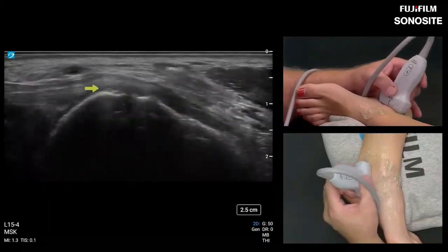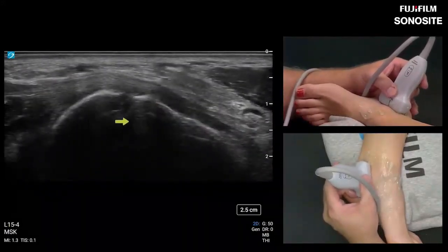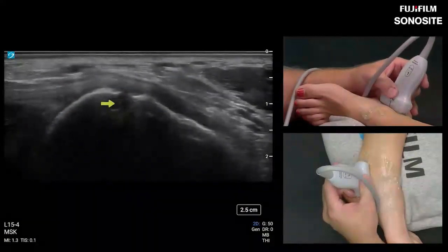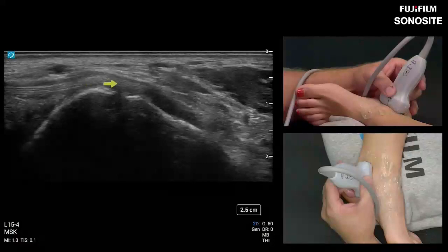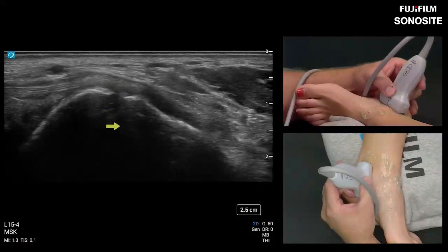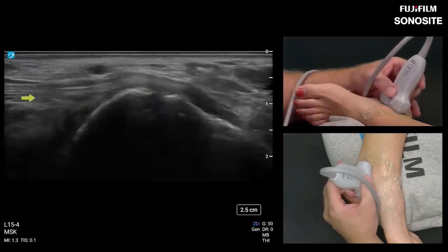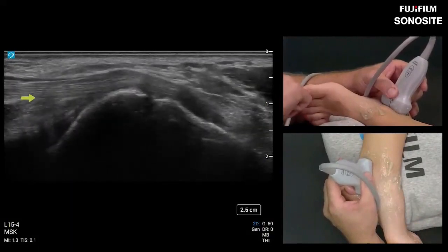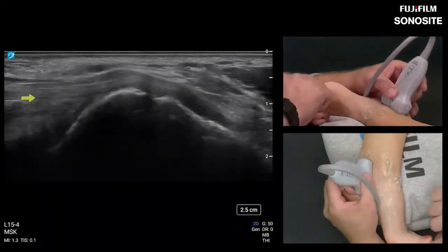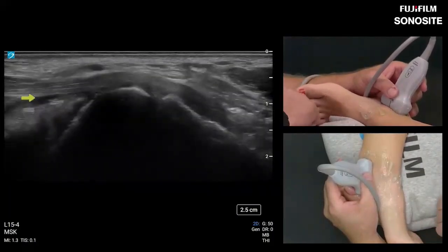So let's get a long axis FHL, and you can see the joint. Here's your posterior subtalar joint right here, which does in some cases communicate with the tendon sheath of the FHL. So you can have a joint effusion outwardly pour its fluid into this tendon sheath in some cases. So keep that in mind, and let's watch this tendon. I'm going to move the big toe just passively. So flexor hallucis longus. I don't know that I mentioned it in the slides, but hallucis means big toe.